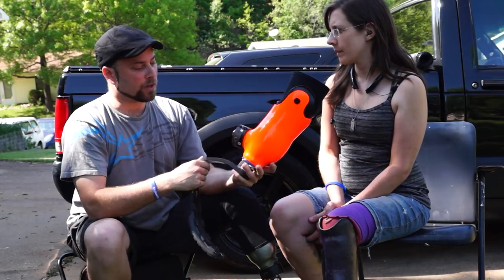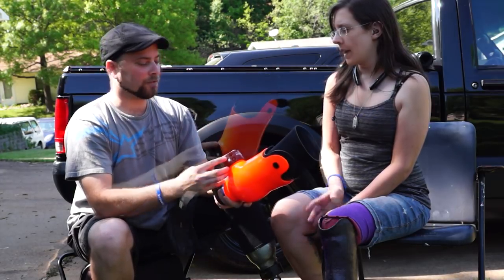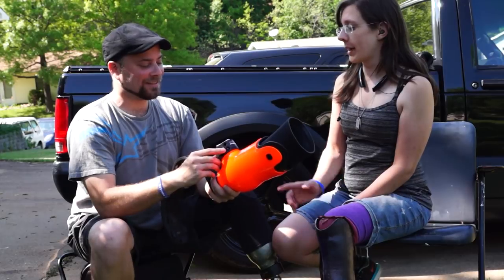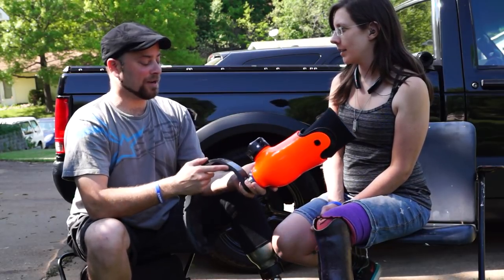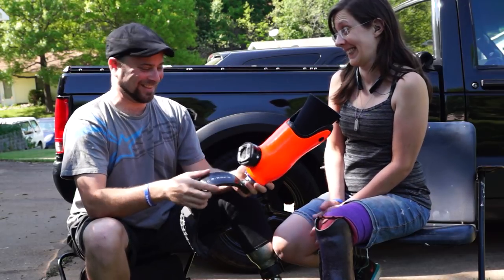On my running leg there was no room underneath for the pump blade, so we had to put it on the back — it kind of looks like a rocket launcher on the end of your running leg. I'm actually going to make a cover for it to make it look like an afterburner, so that when people are behind me they see my afterburner on and know how fast I am.